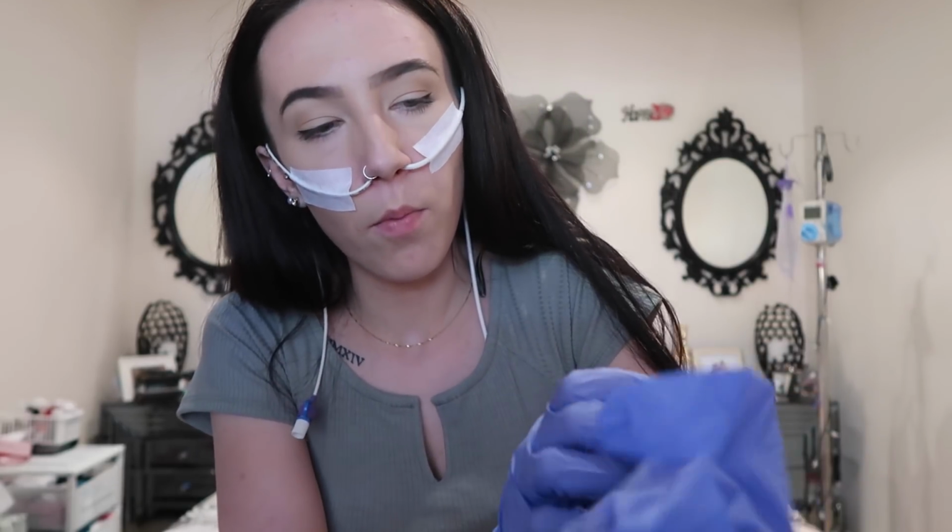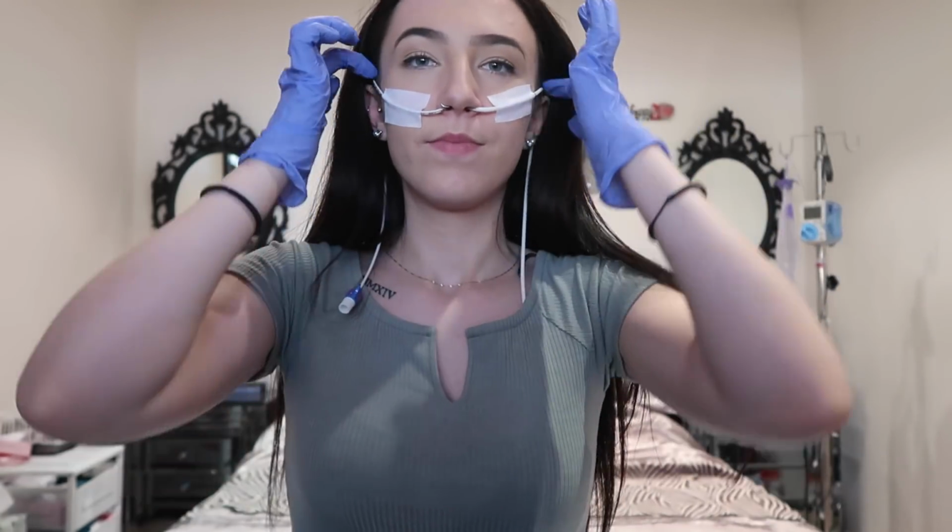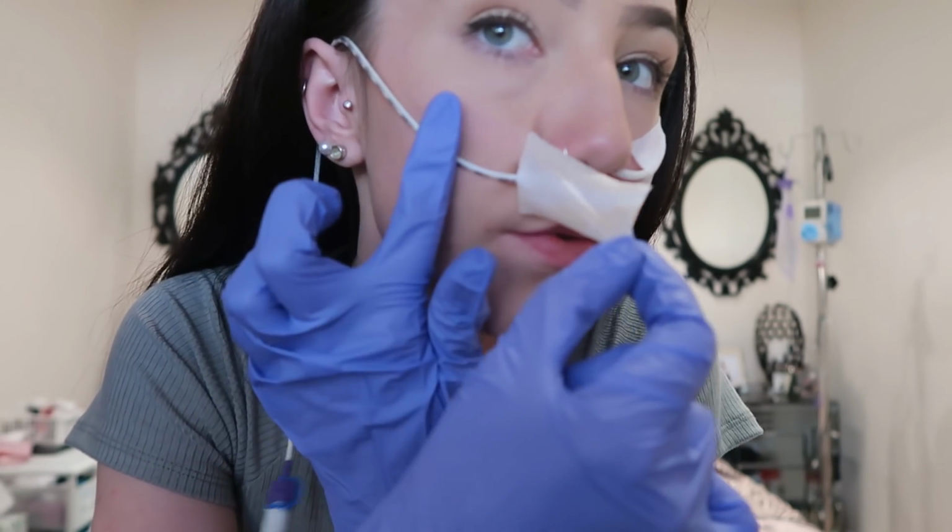So before I do anything, I'm going to pop on some gloves, because you want it to be as sterile as possible. Plus it's not very nice getting a load of gunk from inside on your hands. Pop these on. Okay, so first things first, we're going to just remove this dressing, because we're not going to need it anymore.